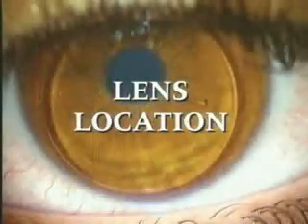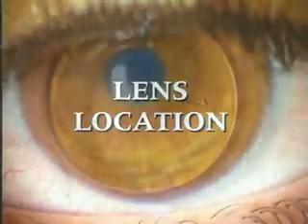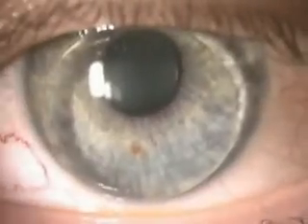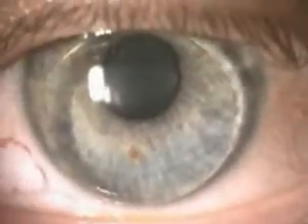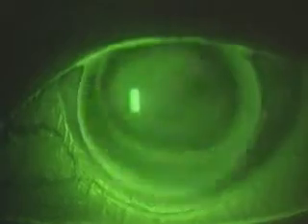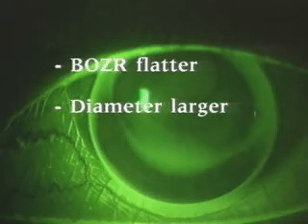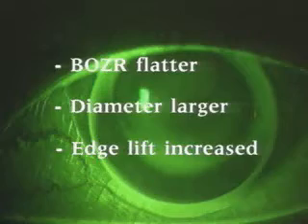Lens location. Many RGP lenses on keratoconic eyes will decenter inferiorly. This is particularly true for the novice wearer due to excess tearing. Acceptable mislocation will see the lens edge on or inside the limbal zone. Excessive decentration beyond the limbus will usually cause discomfort and visual problems such as flare and ghost images. To improve centration when a lens is resting inferiorly, the radius can be flattened, the total diameter made larger, and the edge lift can be increased.